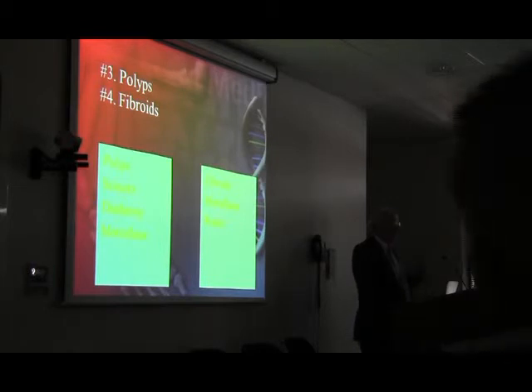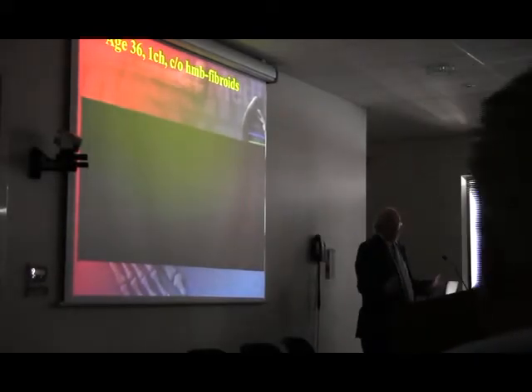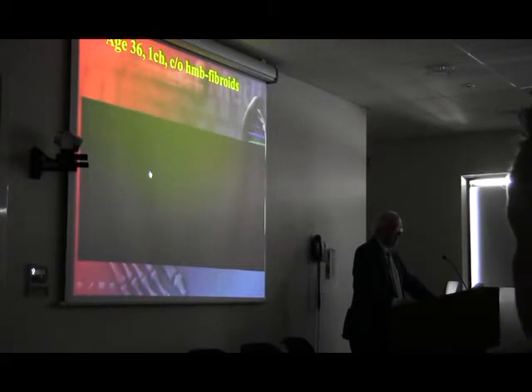And I think the alternative really for fibroids is the old resection. Now, fair enough, maybe with the resectoscope we can get them smaller, but in the meantime, I have a 36-year-old here with one child, heavy menstrual bleeding, okay.